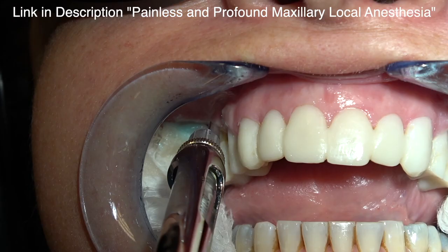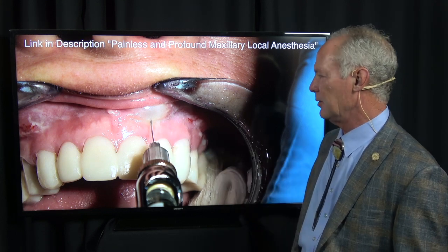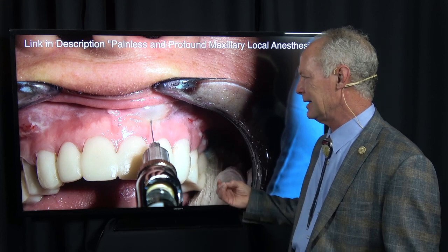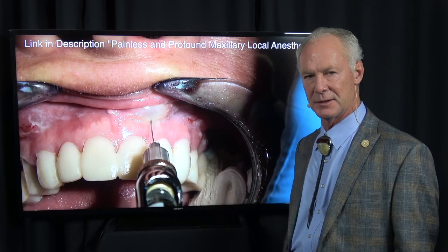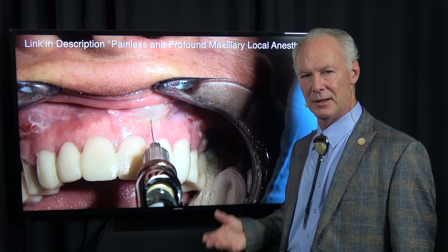Veneers on the anterior teeth. These are provisional restorations, which we talked about in the last part. So I'm administering painless and profound local anesthesia. Watch the video in the library of DentistryMasterClasses.com on how to administer painless and profound local anesthesia. If you can't do that, you're behind in the dental game.